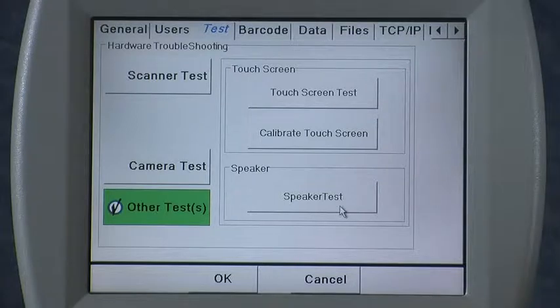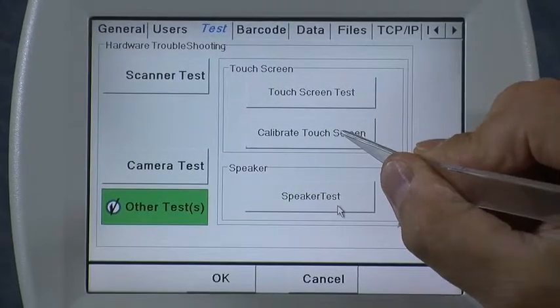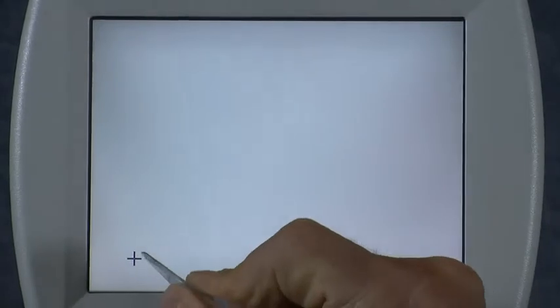That doesn't need to be done in the field very often, but if it does, you simply go to that menu and press Calibrate Touch Screen, then touch the screen at the center of the five crosshairs that will appear sequentially on the screen.